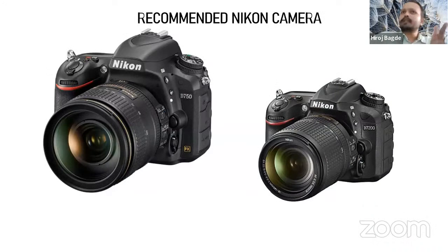I have recommendations for Nikon. I have recommendations for Canon. So for Nikon, we have D750. Whatever things I am telling is from my personal experience. This is the thing which has to be bought as a startup for anyone who wants to go ahead for dental photography or macro photography. I am telling you because there are cheaper cameras than this.